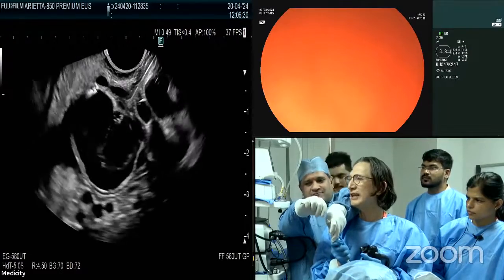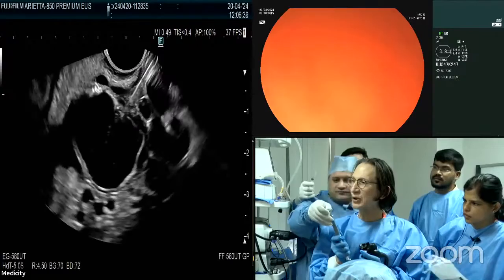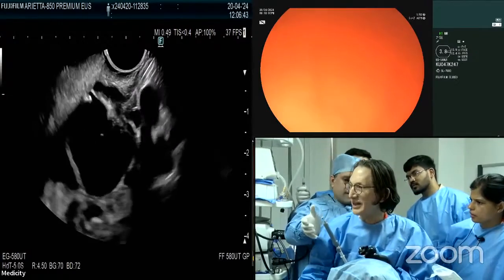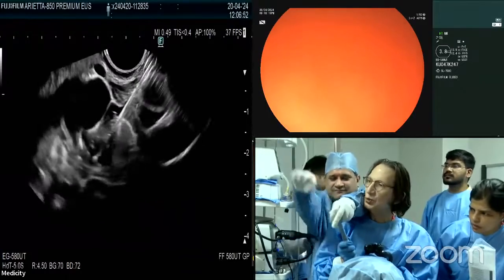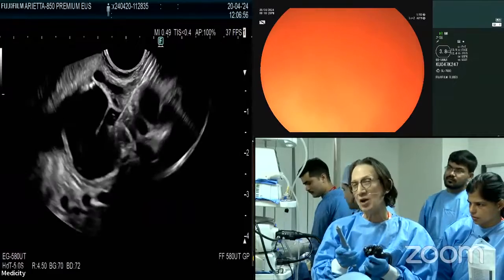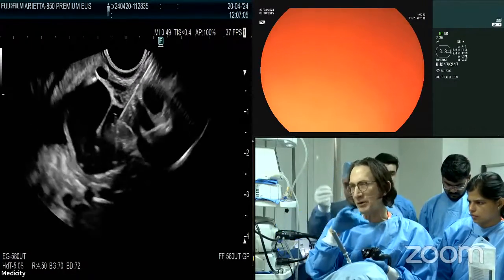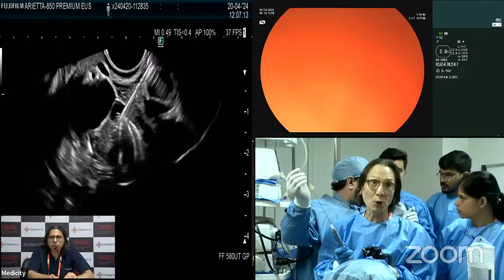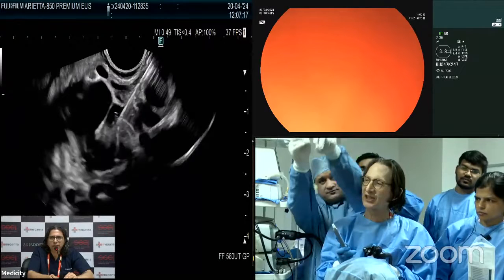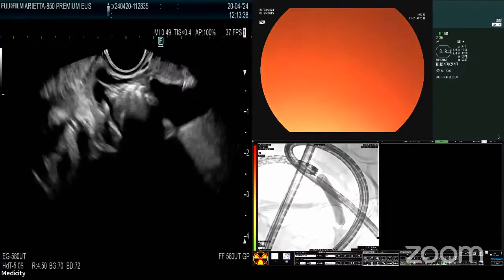Just holding my position — the second coil should come out soon. The flow in these varices can be really quite vigorous. The second coil is in. I think a third coil would be appropriate. You can see the coils starting to fill — the idea is to have a sufficient scaffold that will hold the glue in place and prevent it from embolizing systemically. There's very rapid blood flow in these varices, especially when patients have large gastrorenal shunts. Let's put one more coil in, then I'll show you the glue injection. There are the coils inside, right here.